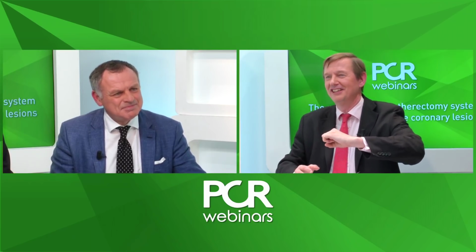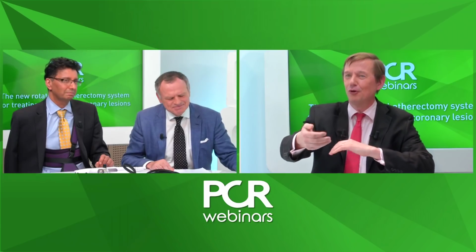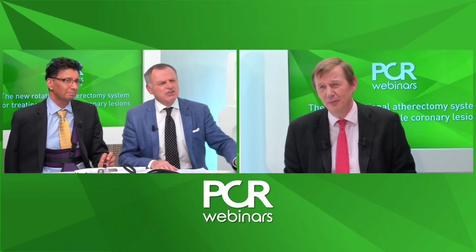Sometimes you also need to improve your support. Sometimes it's related to the fact that you did not choose the right guiding catheter, and it can sometimes be solved by changing the guiding catheter. The guiding catheter helps the device push forward, and if your guide is out a little bit, the transmission of the force comes back rather than forward. So the guiding catheter is a key element to good rotational atherectomy technique.